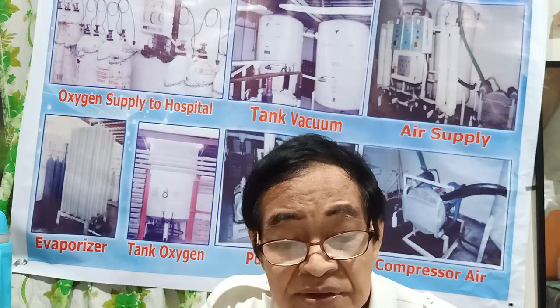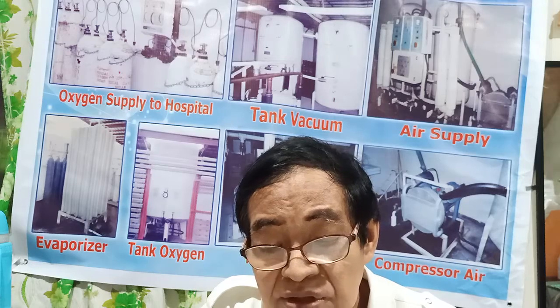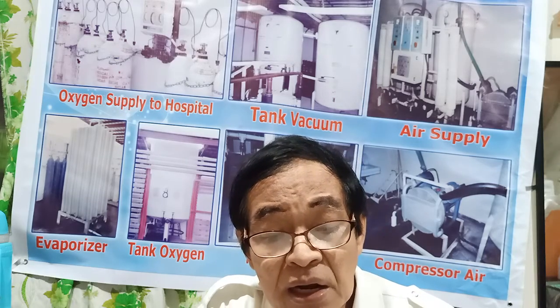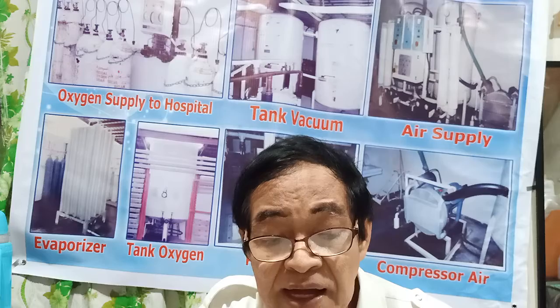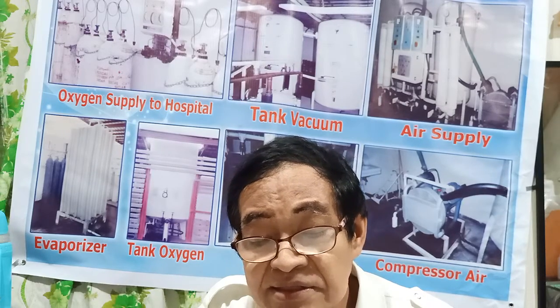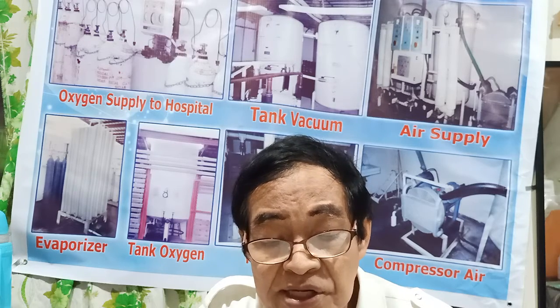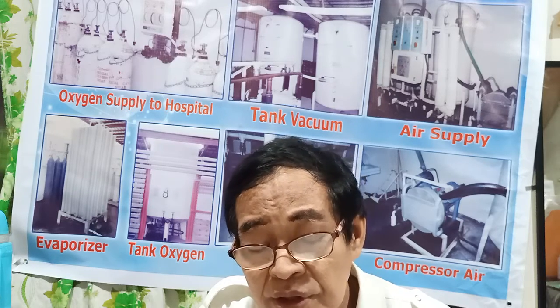It's about the asphyxiation. The controlled release of cryogenic liquid leads to the formation of a large volume of gas as the liquid evaporates. This gas does not mix well with air because of its low temperature.